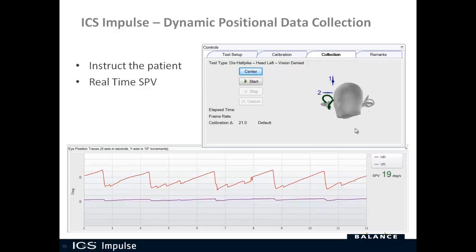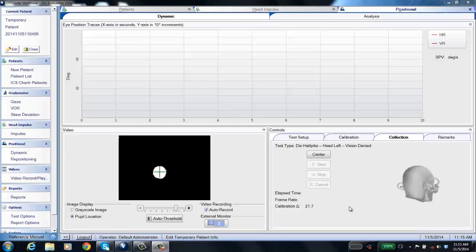And then you'll see these different angles. Now this is an example of Dix-Hallpike. Here it also highlights in green the canals that you're testing. You're turning the head 45 degrees. As you turn the head 45 degrees, the little blue ball should match up with the line. So that's step one. And then when you bring the patient backwards, that ball will then hit step two when you're positioned properly.